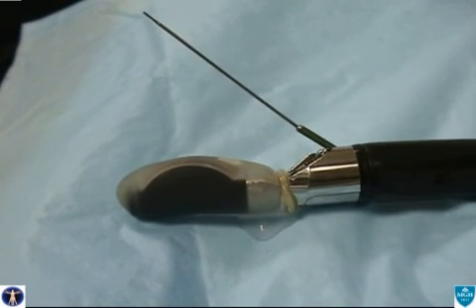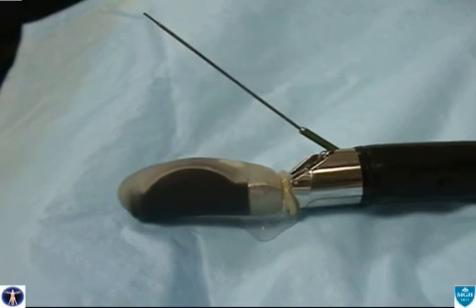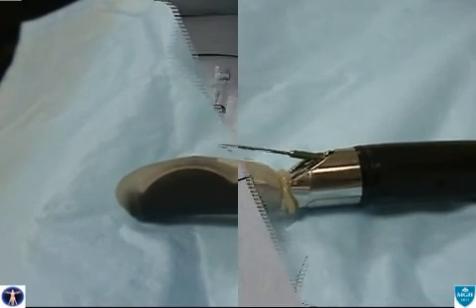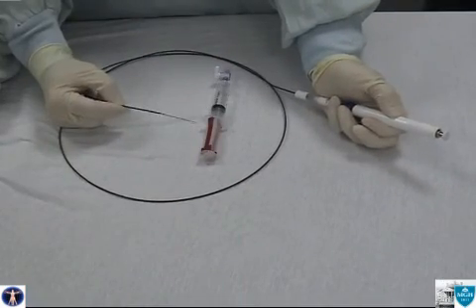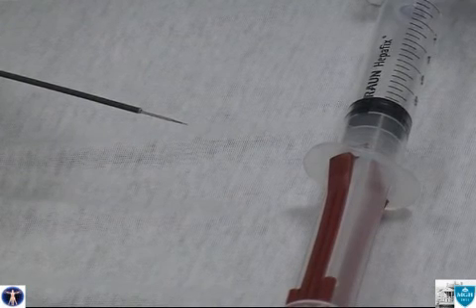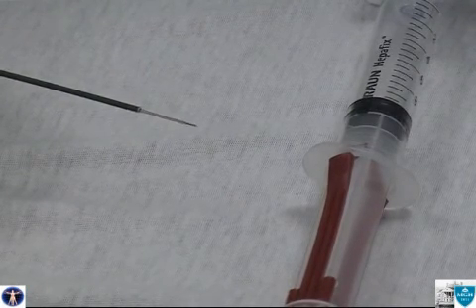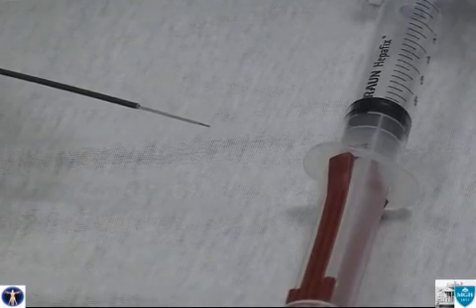One can see the fine needle aspiration device protruding from the instrument channel, and an elevator controls the excursion of the needle. Prior to FNA, we'll assemble a single-stage Wilson-Cook FNA device. One can see a 22-gauge needle protruding from a coiled metal sheath. Protruding from the needle is a small stylet.